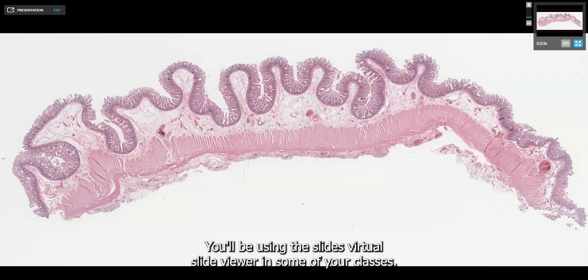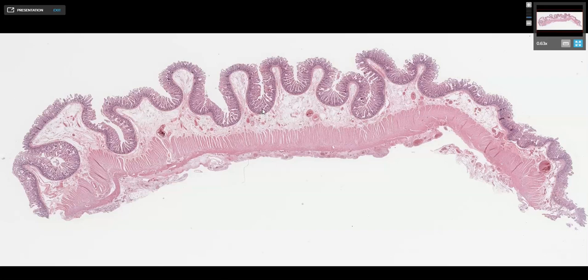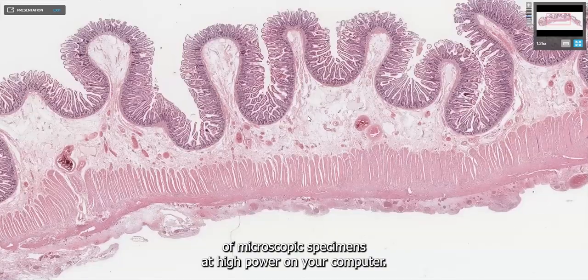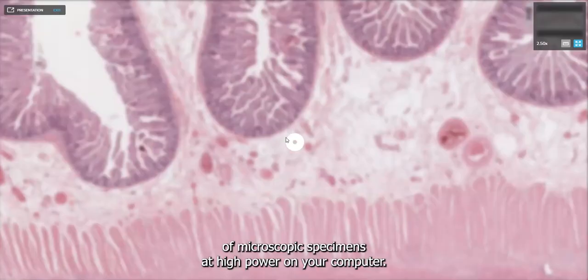You'll be using the Slice Virtual Slide Viewer in some of your classes. Virtual slides allow you to view features of microscopic specimens at high power on your computer.